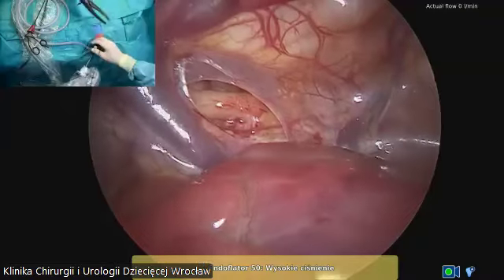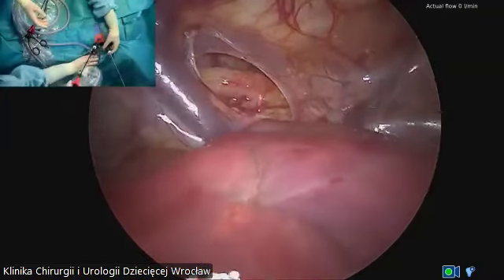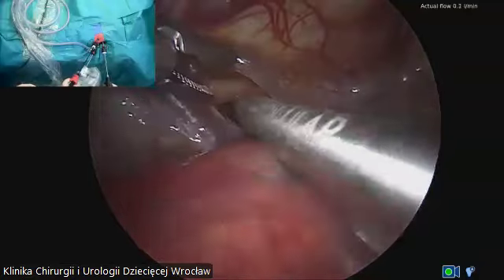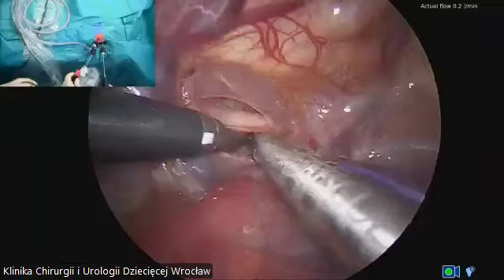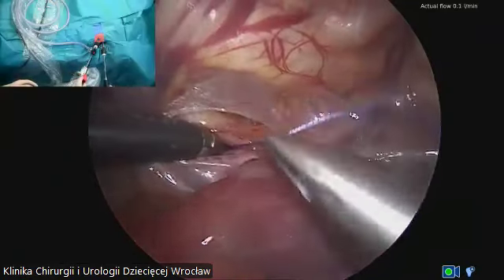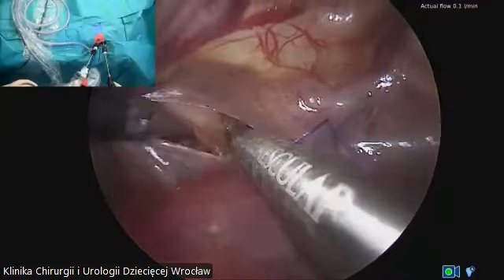So this is why we'll not do the anastomosis today. And the baby is very small. It's a premature baby. So we would like to improve its respiratory conditions. So this is why today we will not do any anastomosis, just only ligate the fistula to shorten the procedure. And we'll do it next on Monday or something like that, okay?